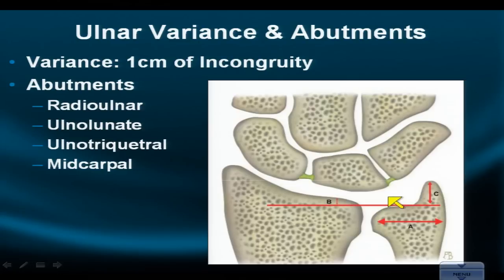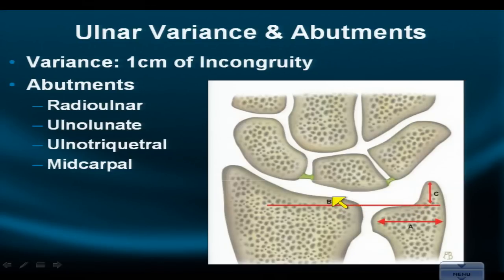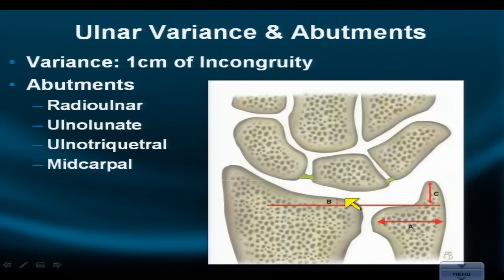When we look at this relationship on MR in a passive, neutral, non-extreme supination or pronation position, if there is a deviation between these two interfaces of more than a centimeter in either direction — in other words, the ulna is protruding more than a centimeter distal or is more than a centimeter proximal to this surface — then we'll say the patient has abnormal positive or negative variance posture.